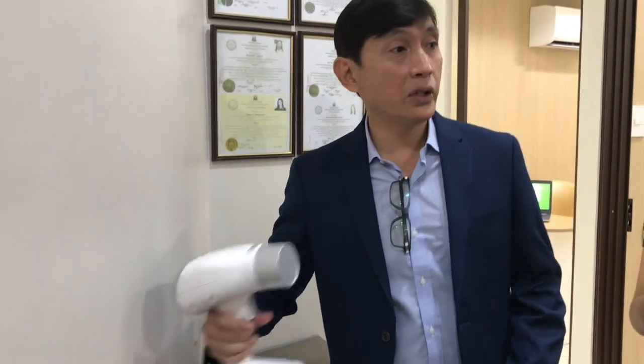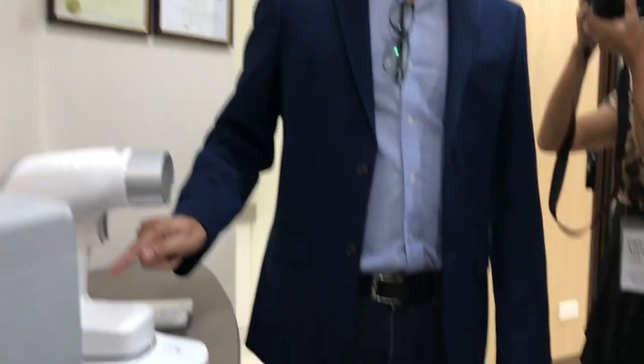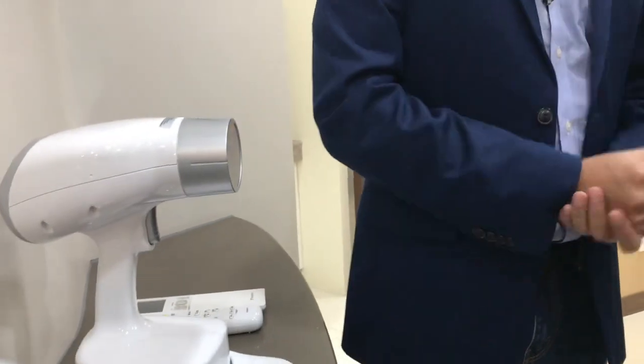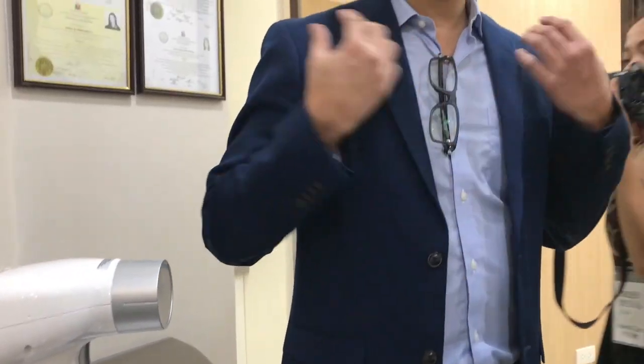With this one, you just stay there in your chair, and we'll do the X-ray. Just sit down. It's very convenient. This one also has low radiation, so much that even the operator doesn't have to wear any protection. Only the patient, because all the radiation is going that way.